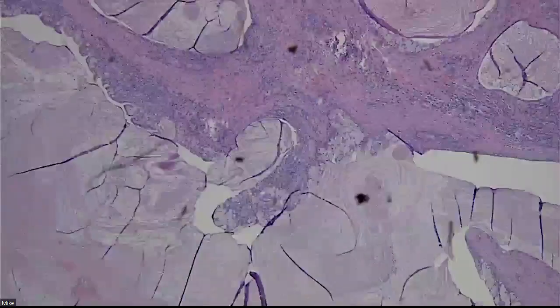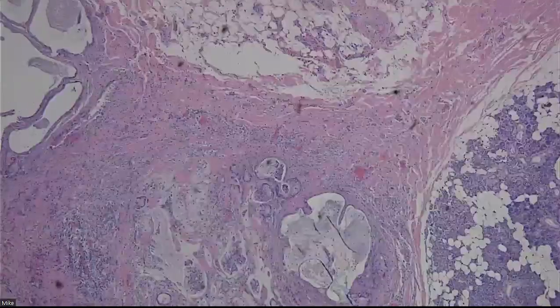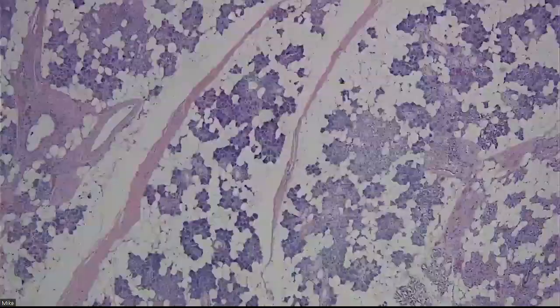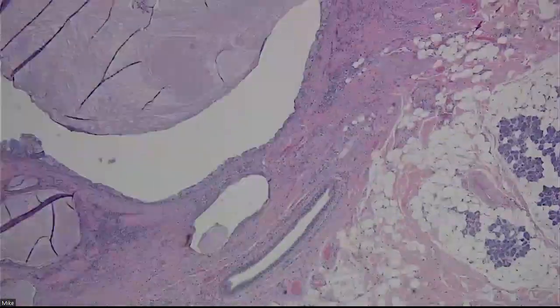So necrosis kind of took you off at all? Well, I'm not sure that it's necrosis. I think it's just grungy mucin. So to call something necrotic, I actually want to see ghosts of dead epithelial cells. In this case, I think it's just sloughed off product.